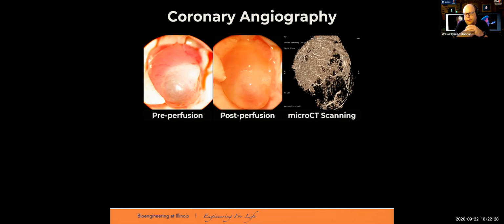I mentioned to you last time that at some moment I had a request from the Museum of Natural History to image a calcified specimen, which looks like a very small stone, and we were actually able to visualize the structures within this calcified specimen. For this, you actually require a very high energy just to pass through the specimen. So that's why the energy. The energy is probably overkill for a little mouse, but those scanners are kind of universal. It's not only for in vivo imaging, but also for specimen imaging, right?